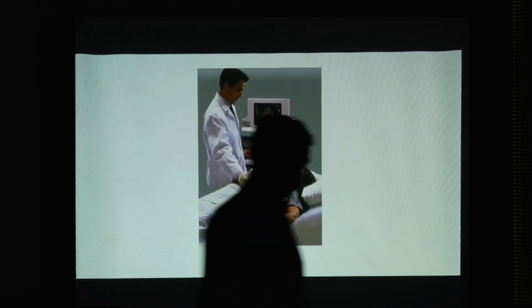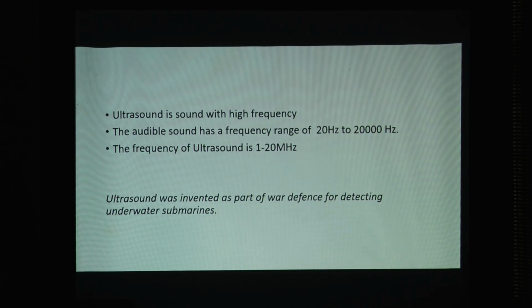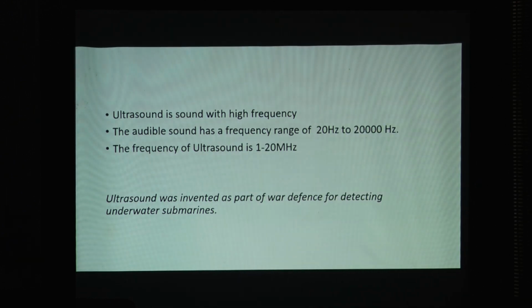As you all know, this is the ultrasound examination being conducted. Ultrasound is sound with high frequency. The audible range is 20 Hz to 20 kHz. The frequency of ultrasound used in medicine is 1 to 20 megahertz. Ultrasound was invented as a part of war defense for detecting underwater submarines, etc. Now it is used for sterilization of equipments, to detect flaw in metals, etc. It has wide uses, but the megahertz we use is 1 to 20.